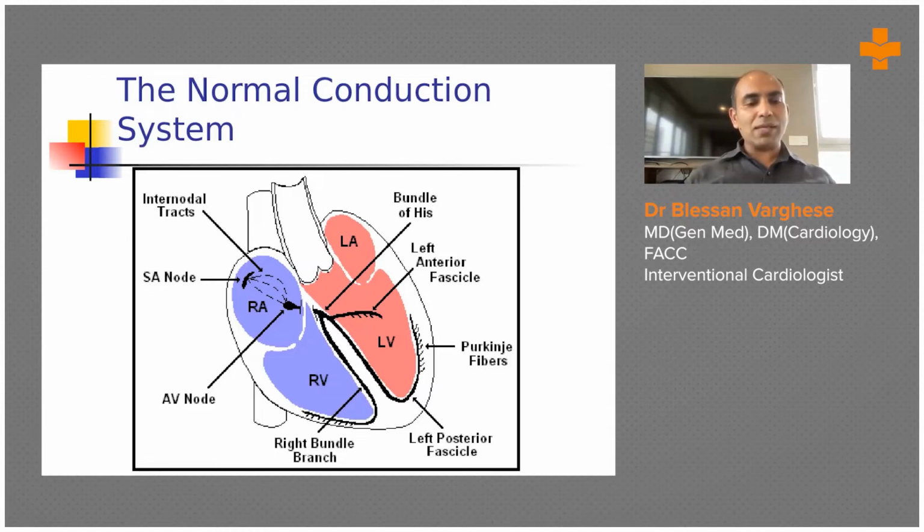So what you are doing is placing two electrodes in two areas on the chest, and the potential difference between these two electrodes is recorded as fluctuations. We do this graphical representation on a particular designed paper, so it becomes what we call the electrocardiogram. The basic voltages are created on the surface of the heart, which are augmented and transduced to a written form. That's what we call ECG.